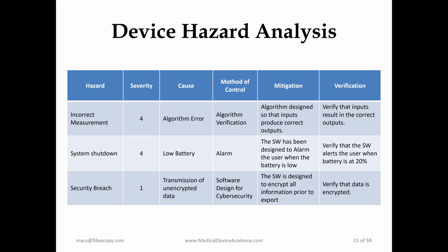And I also want to point out here that while these are deliverables for the 510(k), they're also described in IEC 62304, which is that main software standard that we were talking about. So the FDA guidance identifies what you need to include, but 62304 is really a good source for more detail and description and information about what these specific deliverables and documents should have within them. So, next slide, please.